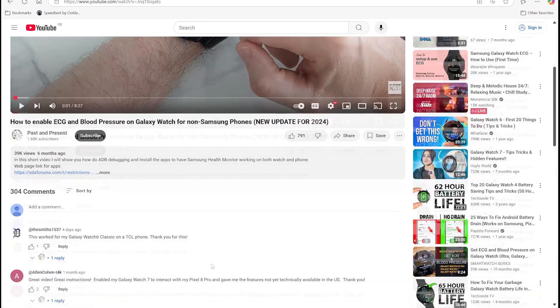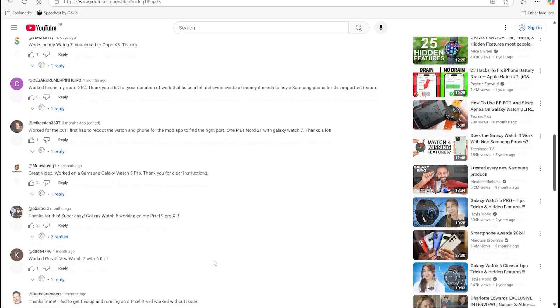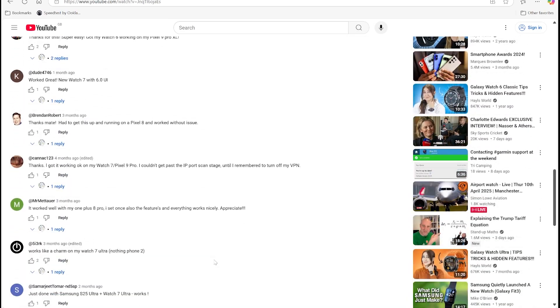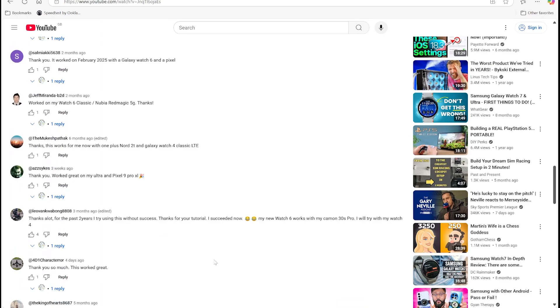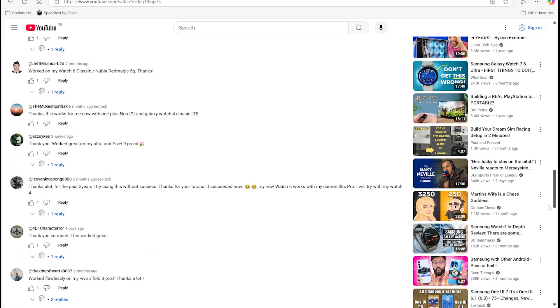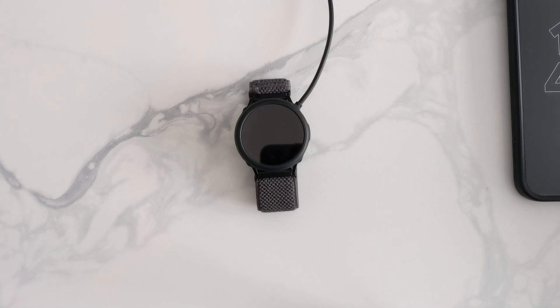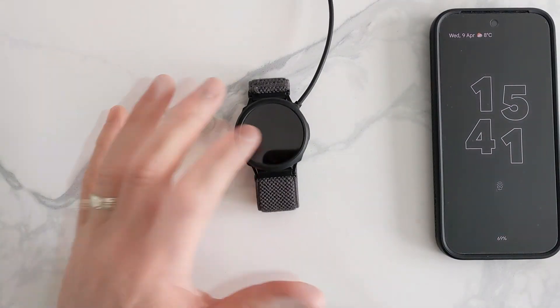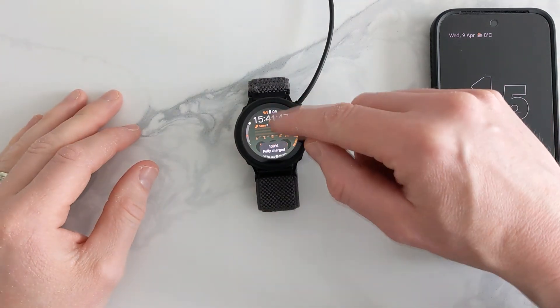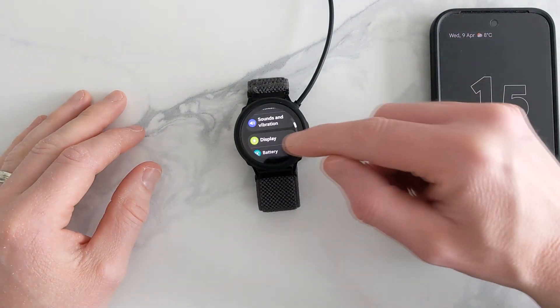This is a recent video I made showing you how to install this app and put it on a non-Samsung phone. The majority of comments are from people getting it to work with no problem, but there is still about 10 to 20 percent having problems with it. So this is a fresh install — I'm using a different phone, this is a Google Pixel 9 Pro, and I've reset the watch.